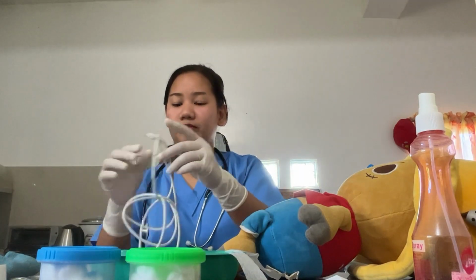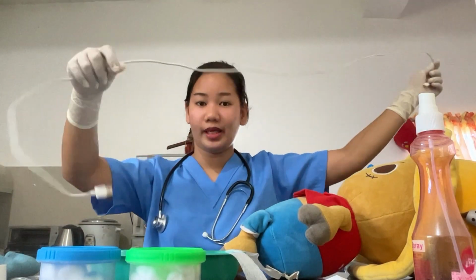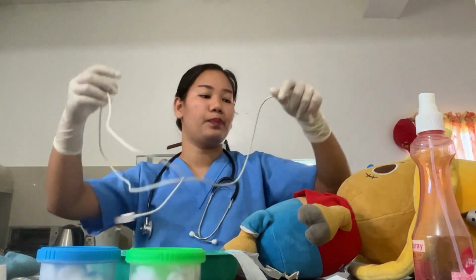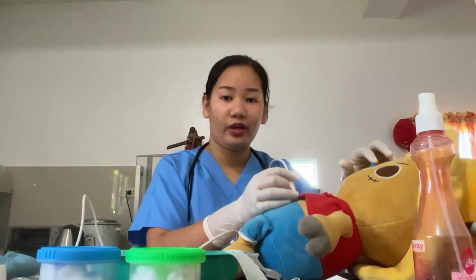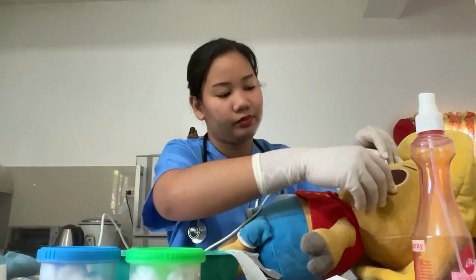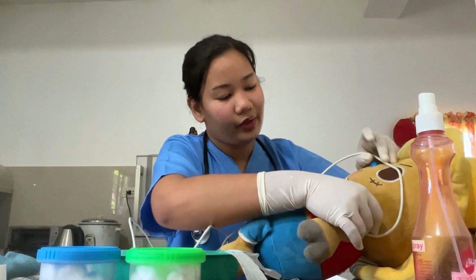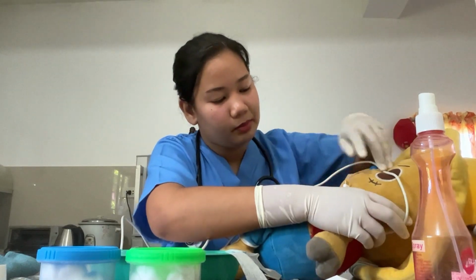So then after explaining that, we will now get this tube and then we will measure this. So let's assume that this connector is an NGT tube. So from the tip of her nose to her earlobe, down to the xiphoid process, below is our stomach or sternum.